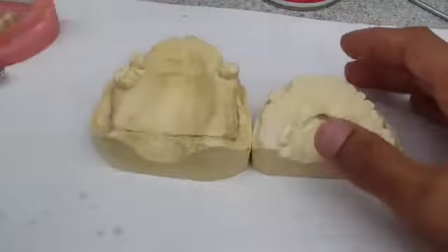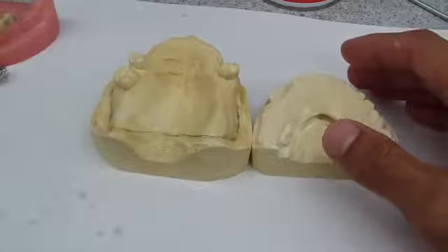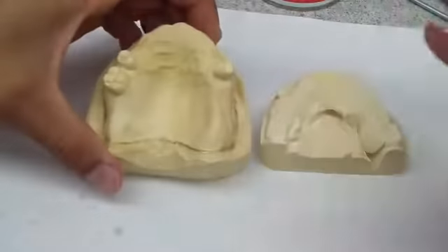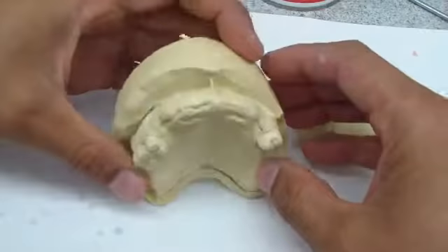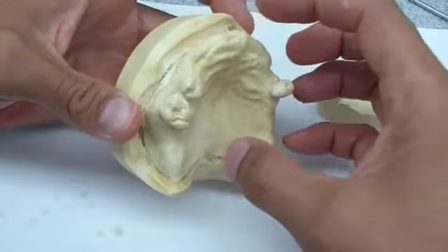Hey folks, Ashley, allthingsdenture.com. I just want to talk about fabricating a jaw relation record for this patient here, or maxillomandibular relationship record. This is Aaron, and we're going to be fabricating a complete maxillary immediate denture.